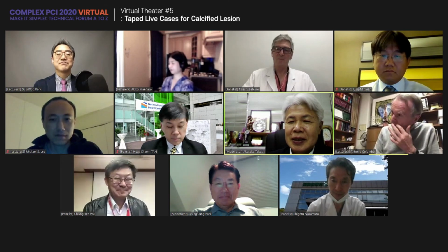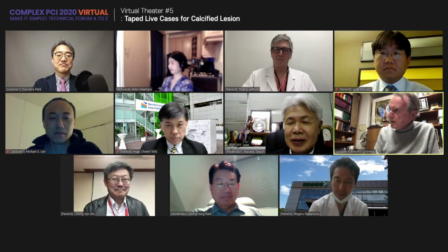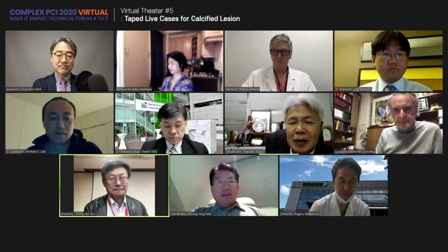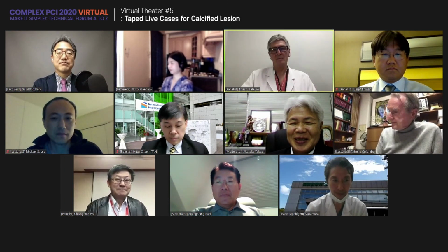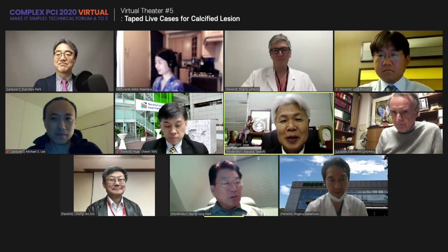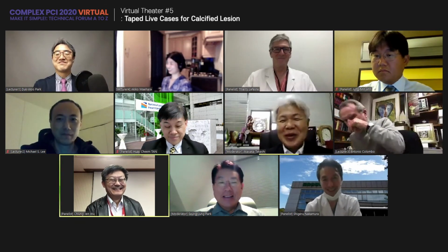We got expansion after failure of the NC balloon, and cutting balloon at high pressure was successful. True, we have the same experience. But it's off-label. Okay. Takashi? Yes, it's close. Yeah, right. Okay, yeah.